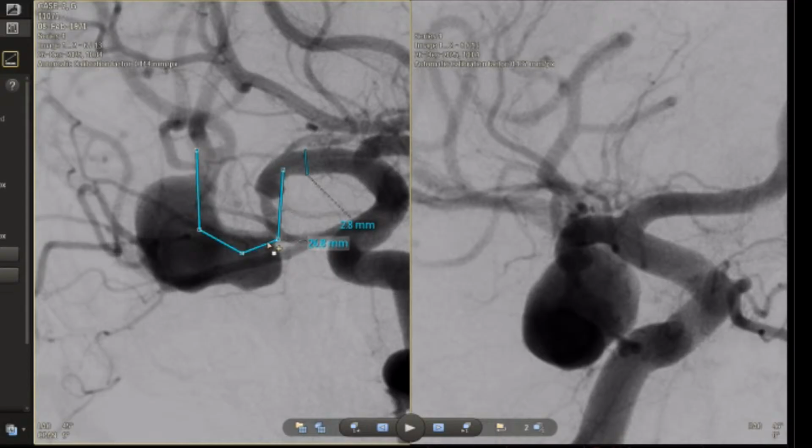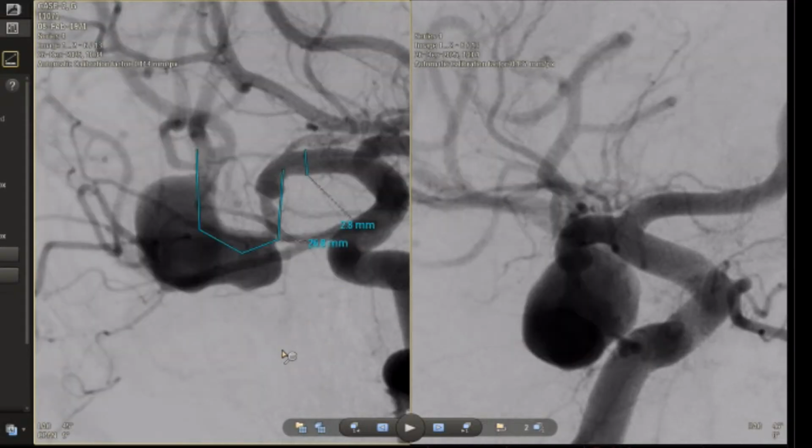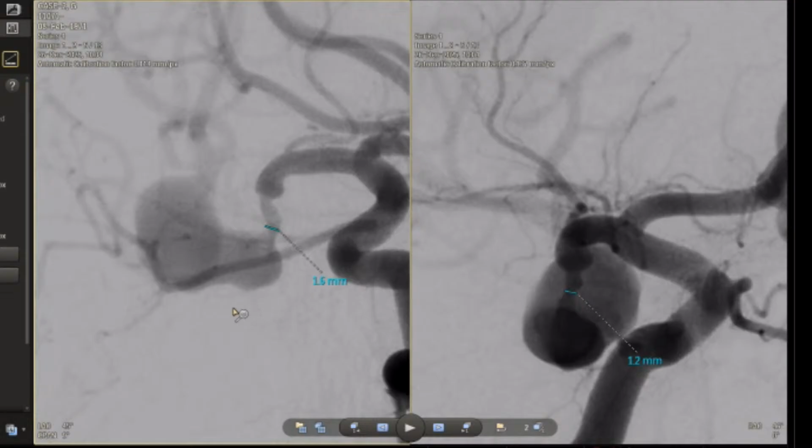Another question, should we do angioplasty? With the 2 millimeter balloon, it's possible to do angioplasty here. No. We can start with the angioplasty and then place a stent. Okay, let's take Xeon Blue, coronary balloon 2x9.